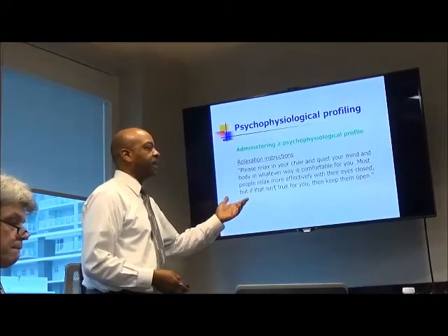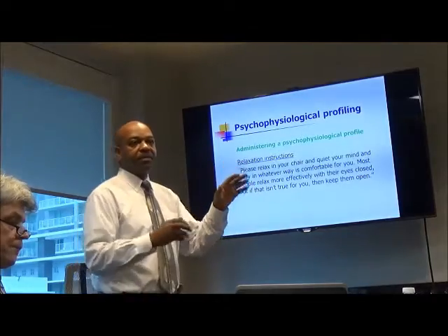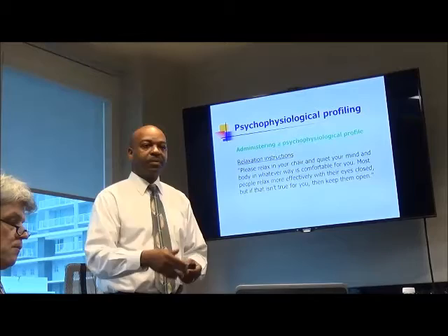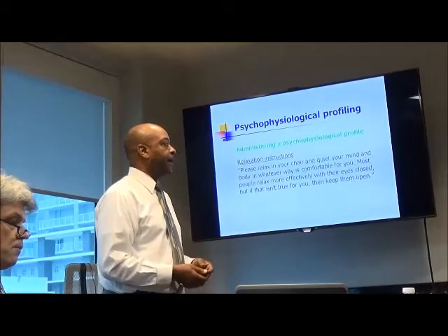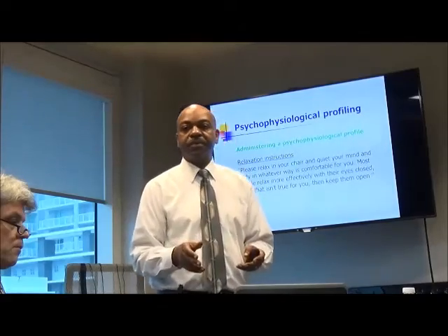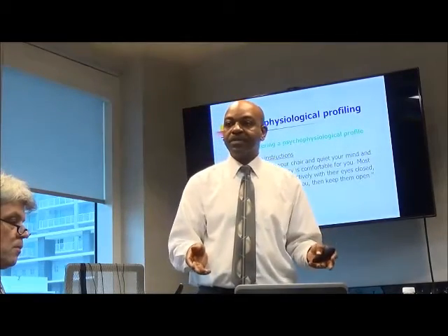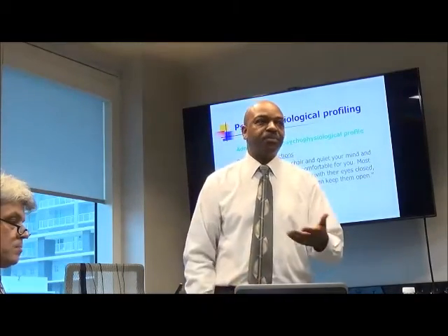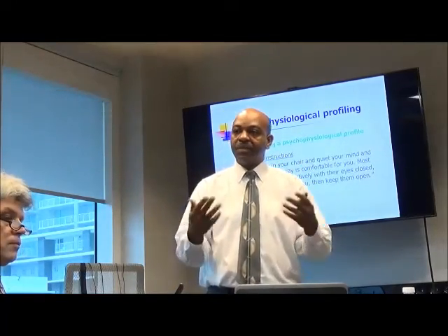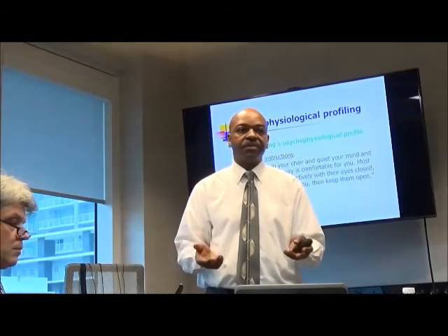So basically, I usually will tell the person, for the next 2 minutes, I just want you to relax. I don't go into imagery or anything like that. And also, it's important to tell the person, before you put all these sensors on them, something to the effect that I'm going to apply some sensors to you to measure how your body reacts to stress.